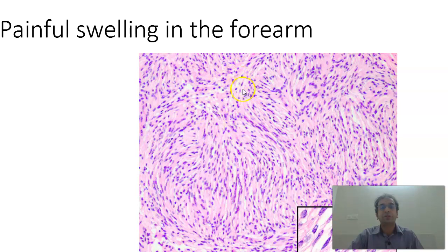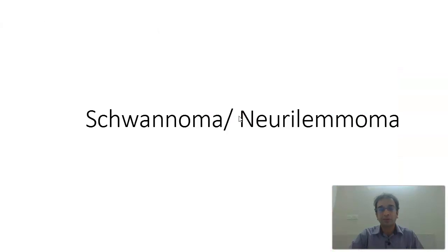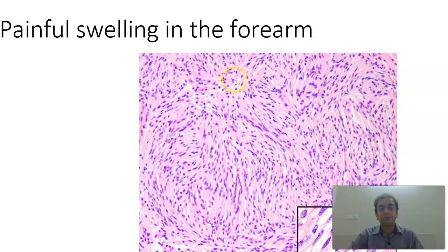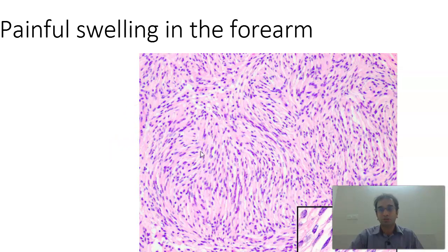Next case is a painful swelling in the forearm. What you find here is an arrangement of cells in the Antoni A and Antoni B patterns. The Antoni A pattern is seen here, and you should be able to appreciate the Verocay bodies — some kind of palisading is there. This is a slide of a schwannoma. Schwannomas are painful swellings. They will have Antoni A areas with the Verocay bodies and Antoni B areas with the myxoid, looser areas.